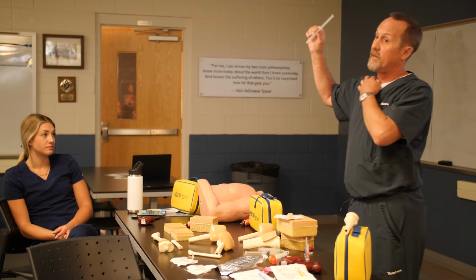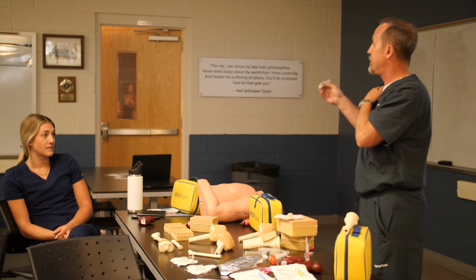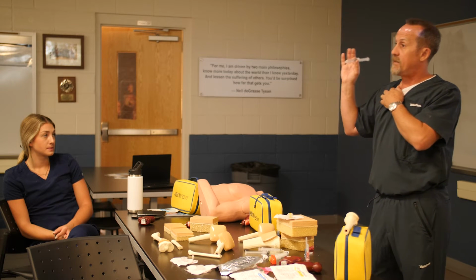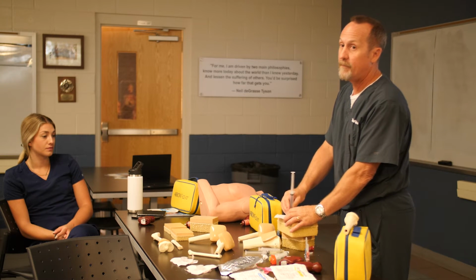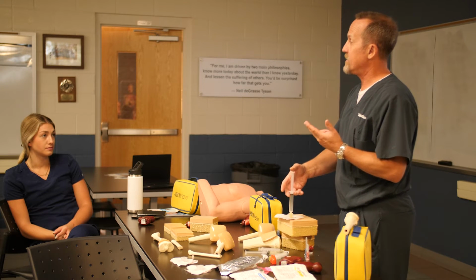So what we're gonna use is the 2% epi-free, non-preservative. Typically, do you guys have the cardiac lidocaine? And it's preloaded syringes in the pink box. So that's the lidocaine of preference, okay? And what you're gonna do is actually hook it directly to the hub, and you're gonna do 2 cc's over 2 minutes.